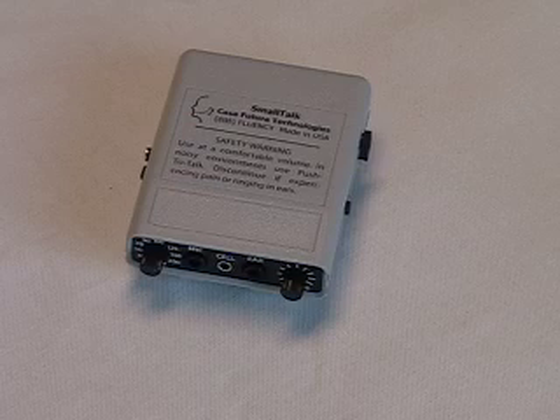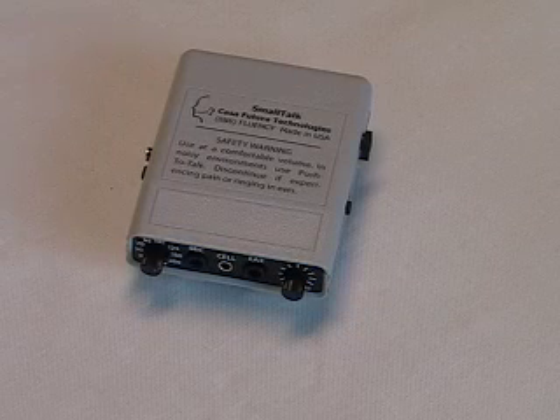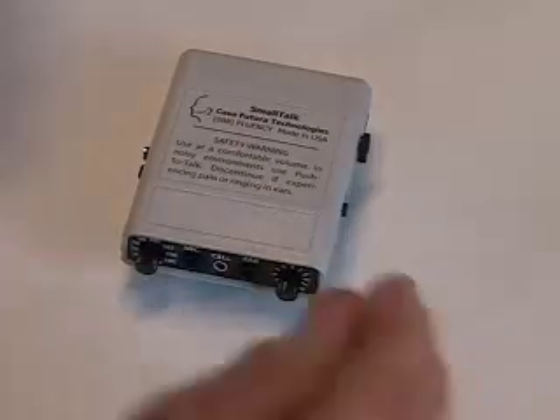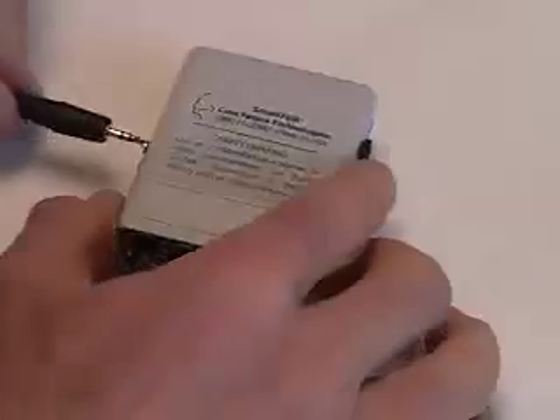The Smalltalk has delayed auditory feedback and frequency shifted auditory feedback. It has jacks for a full-size headset, a jack for a cell phone earset, and a jack for a telephone interface.